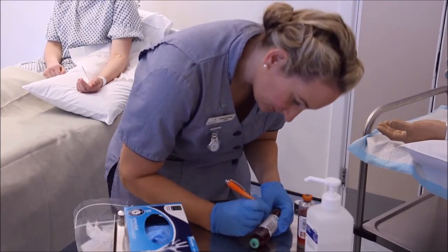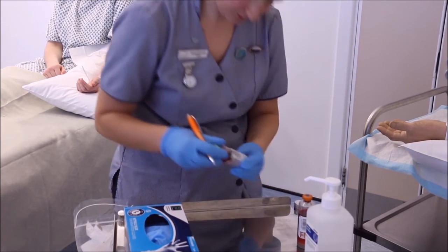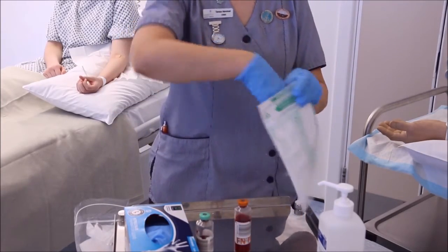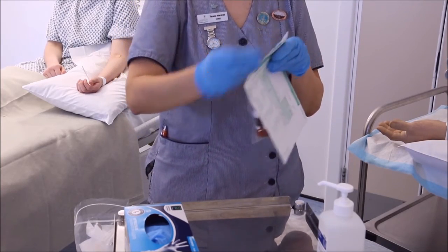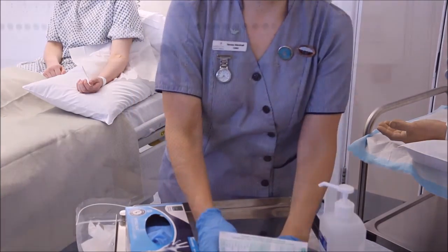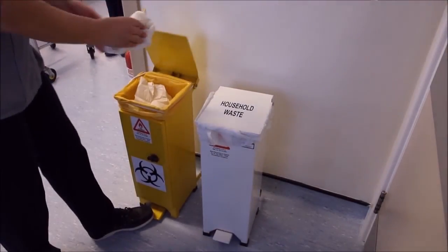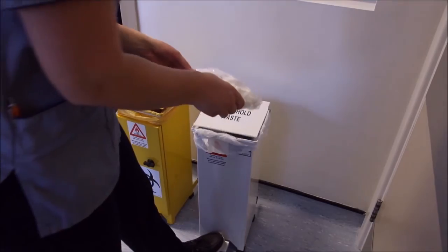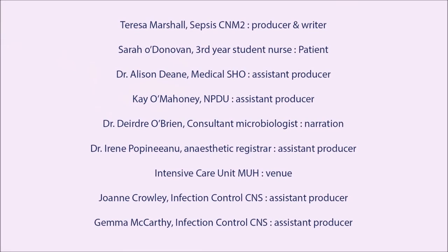Correctly label the blood culture bottles. Handwrite the patient's details on the bottles, ensuring that the barcode label is not removed or covered. Ensure the patient is comfortable. Confirm hemostasis. Safely dispose of equipment. Remove gloves. Samples now need to be sent immediately to the laboratory to facilitate early detection of bacterial growth and avoid false negative results.